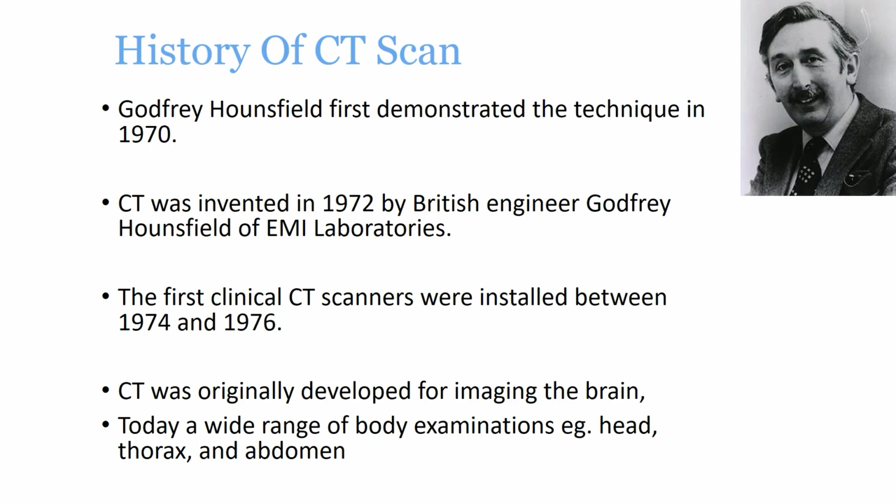Godfrey Hounsfield is called the father of the CT scan, and he got a Nobel Prize in 1979 for discovering it. Originally the CT scan was developed for imaging of the brain, because of the limitations of radiography for brain imaging. Today a wide range of body examinations with the CT scan is performed for the head, thorax and abdomen.